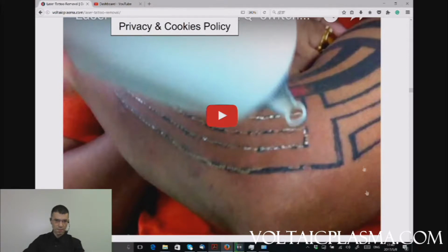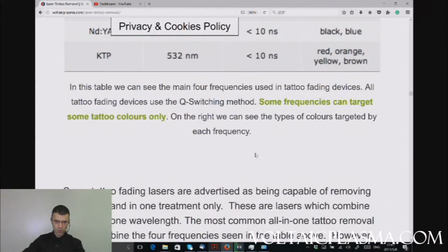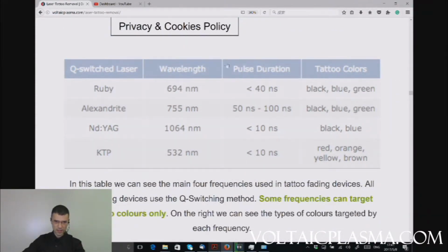This is a video that you can take your time to watch. It shows you one of the many tattoo fading sessions that are shown online. You can see the classic frosting of the area.